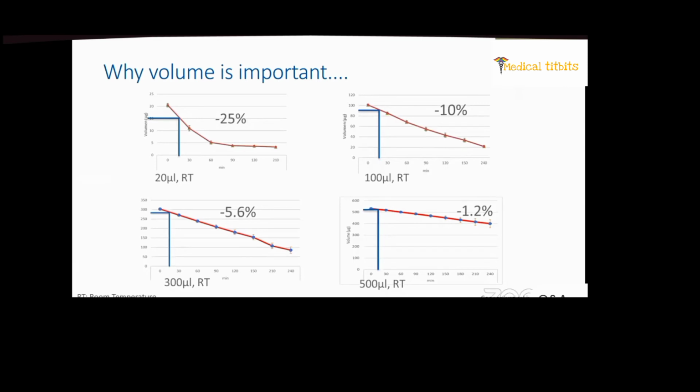It's worth appreciating that volumes of the equilibration and vitrification solutions are crucial to the cryopreservation process. Here's our internal data showing the weight loss observed during the equilibration step using different volumes of solution. The blue lines represent a 15-minute equilibration of a blastocyst. As you can see, drop size will affect evaporation and consequently consistency of the environment surrounding the cells.